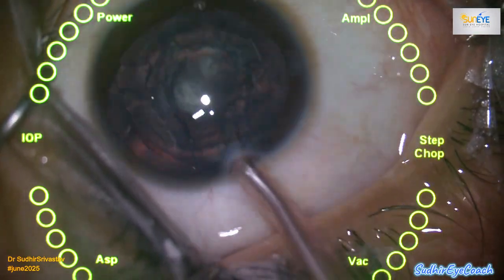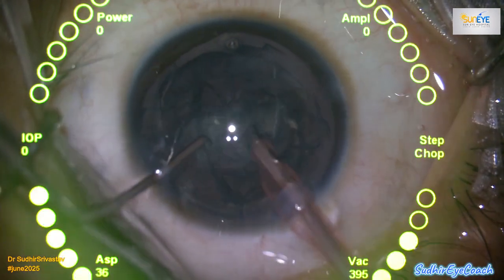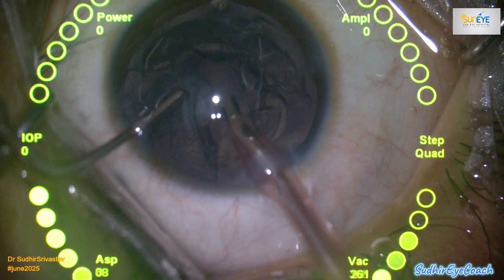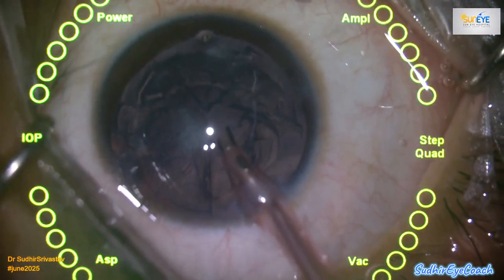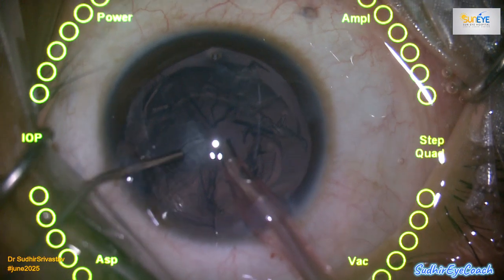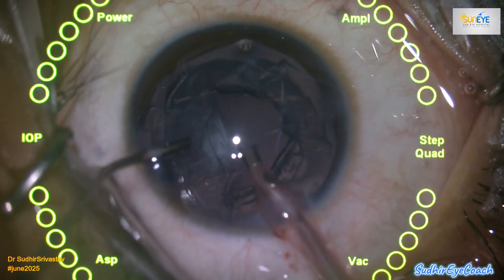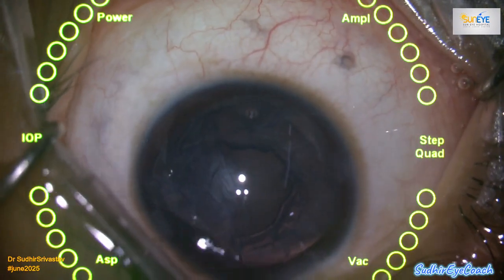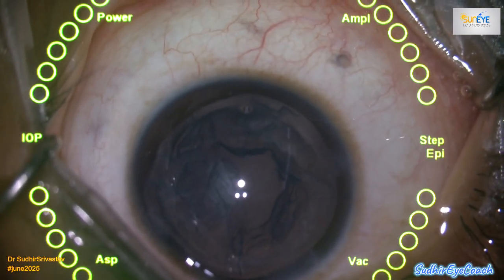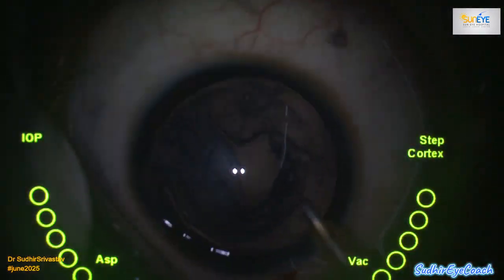Please pay close attention to the video, especially to how we handled the pressure gradients and how we manage them in polar cataract surgery. Avoiding sudden decompression of the anterior chamber is key, and any abrupt change in pressure can lead to a devastating posterior capsular rupture. So enjoy the video, observe the key steps, and take notes of the precautionary measures that helped us achieve a successful outcome in this potentially risky situation.